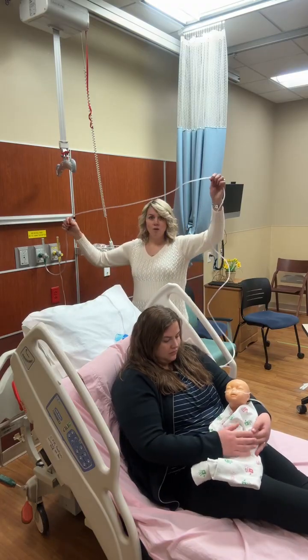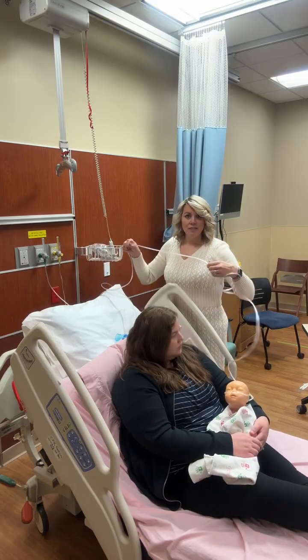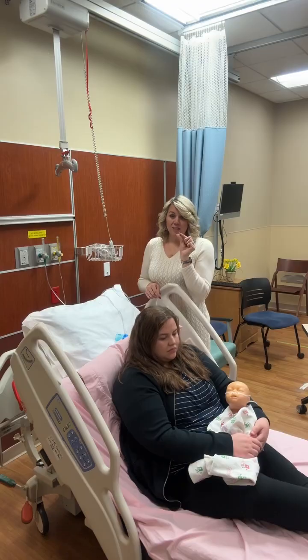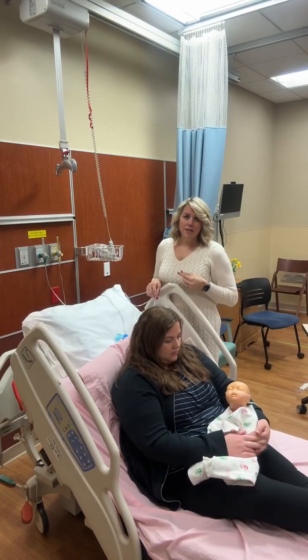I'm also going to check my O2 tubing and make sure that I don't have any little sounds or hissing sounds. Make sure that it's going. You can also just check to see if it's coming out of the prongs, and make sure nothing has clogged it or occluded it.